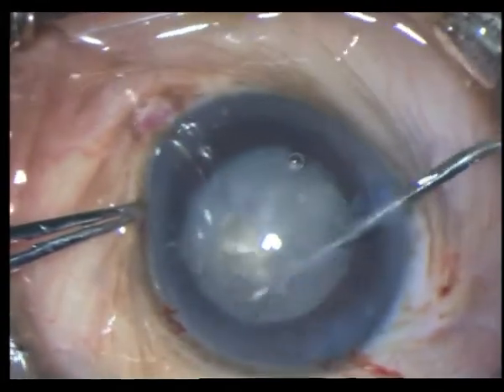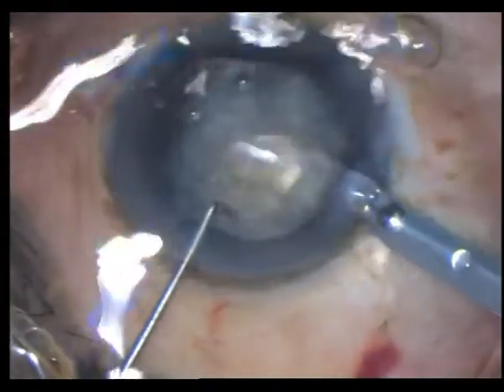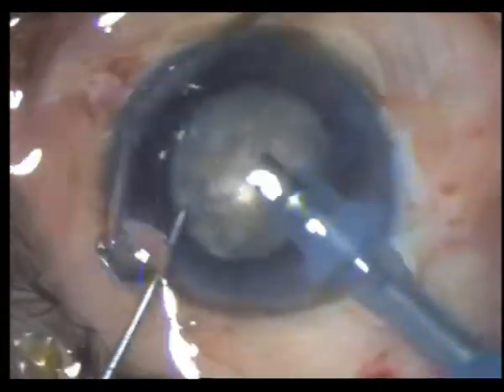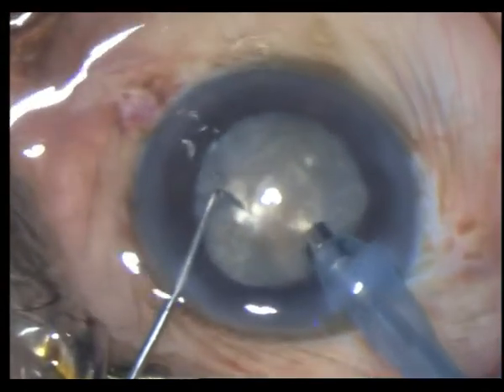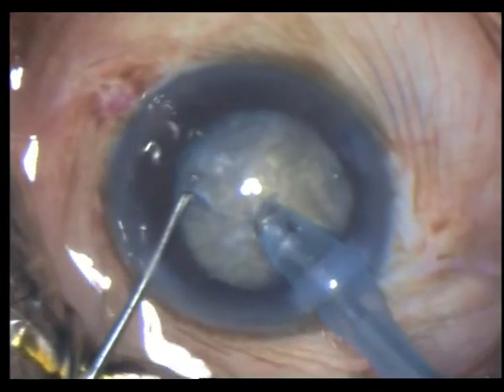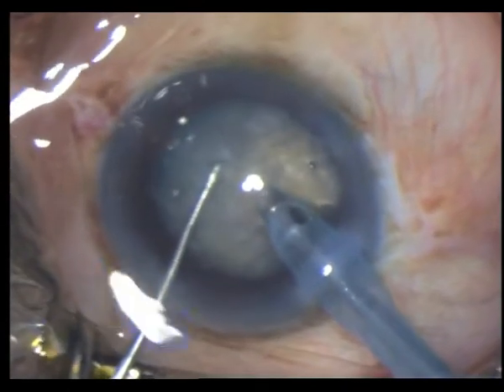Once done, I take a very sharp 2 mm sharp chopper in my left hand and take my phaco and perform what I have always been performing over the years in these hard cataracts — the woodcutter's chopping technique of Dr. Vikas Mahatme. It's pretty effective.